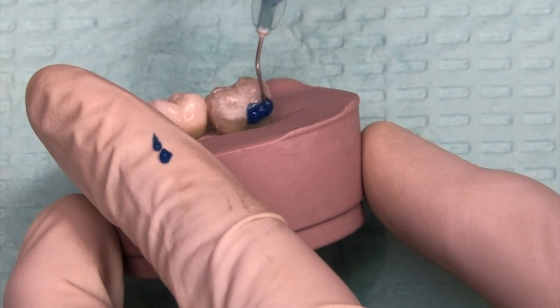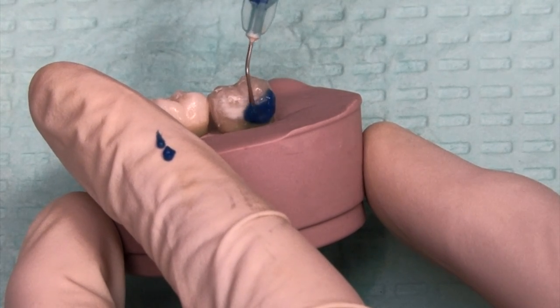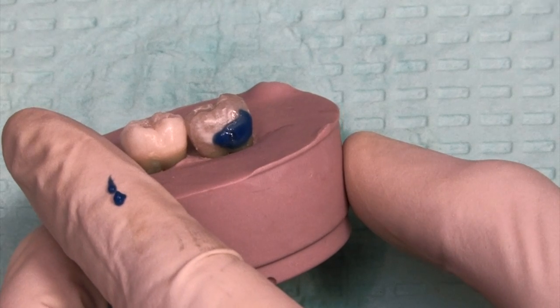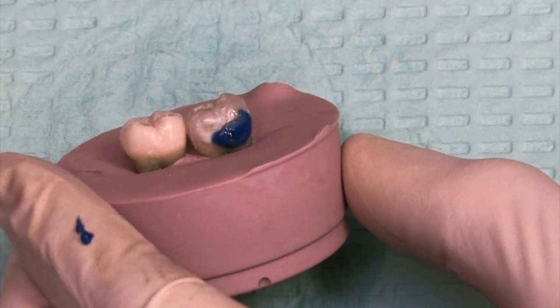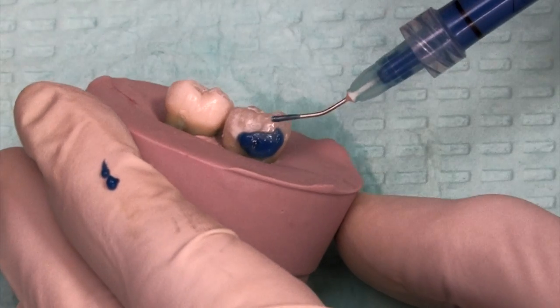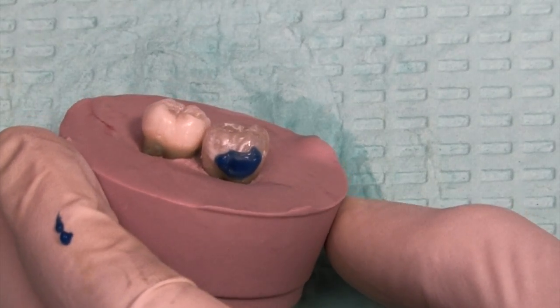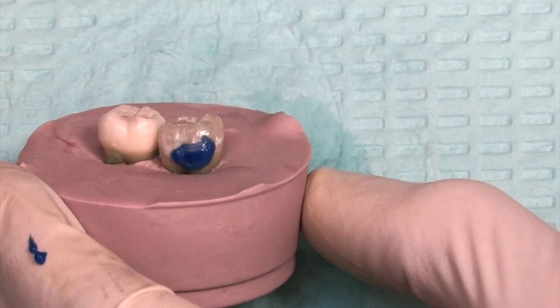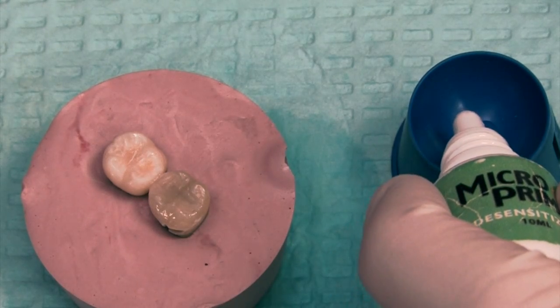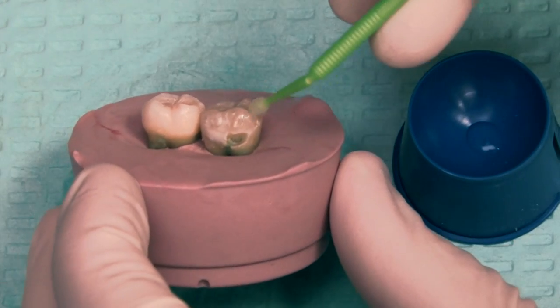We'll use a phosphoric etch — I'm going to go ahead and place it inside the prep and smear it actually outside beyond the extension of the prep itself. I know sometimes when you express that gel it wants to splatter, so I do that on the patient's bib rather than in the mouth. Just let that set for about 15 seconds. Now it's been rinsed off and dried. Using the blue etch is more technique sensitive as far as not having any post-operative sensitivity, so you want to get it rinsed off and just barely gotten dry.